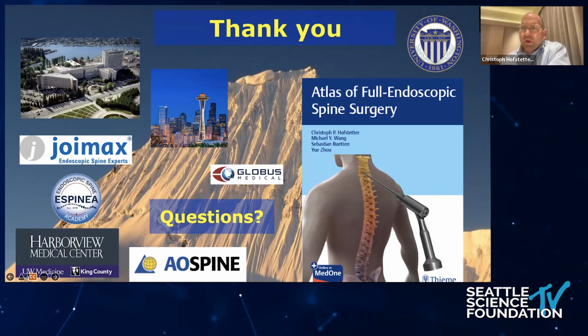In rodents, with doing an appropriate decompression, we're talking about 20 to 30% of neuroprotection. And that's huge. A patient with 10% spared spinal cord tissue can have pretty much a normal functional exam. So the reason I put it in there is because having that imaging in the OR allows you to minimize what you do in the OR, and then really have a targeted approach towards bony decompression or additional maneuvers that you want to do.